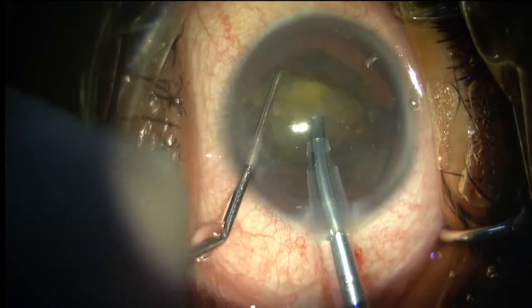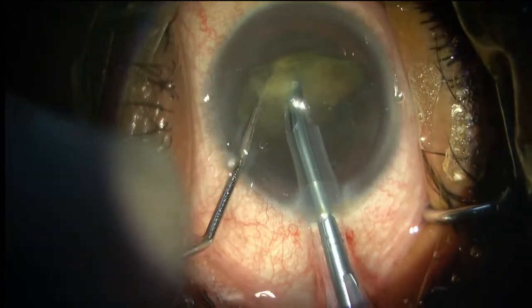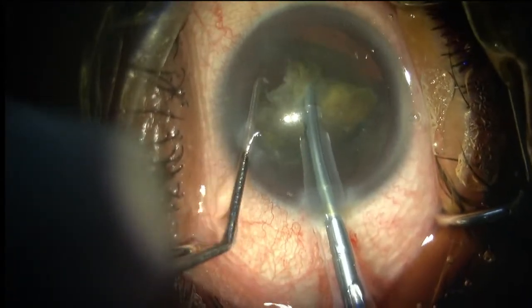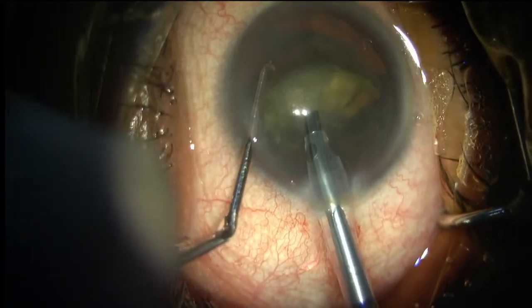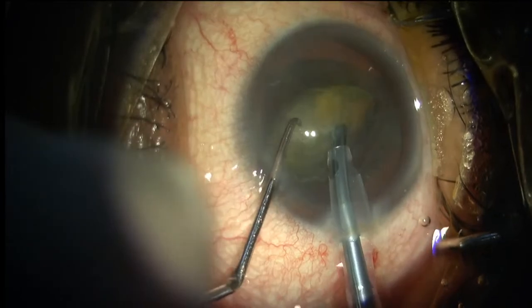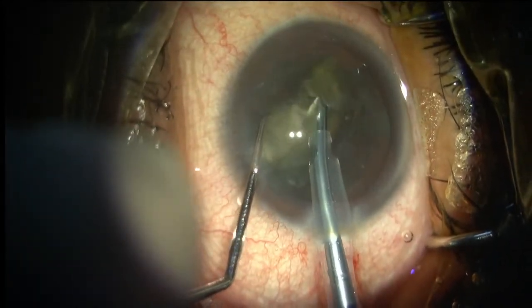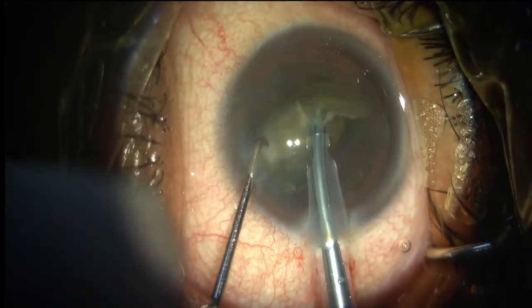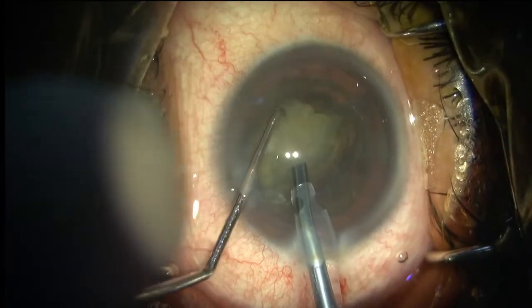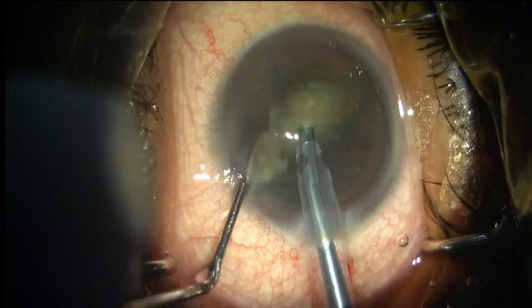So my settings are now vacuum is 500, flow rate is 40, and how much is the power? And continuous irrigation mode on, please. So whenever you are inside the eye, you should always be in continuous irrigation mode, so you don't have to worry about the maintenance of the chamber.